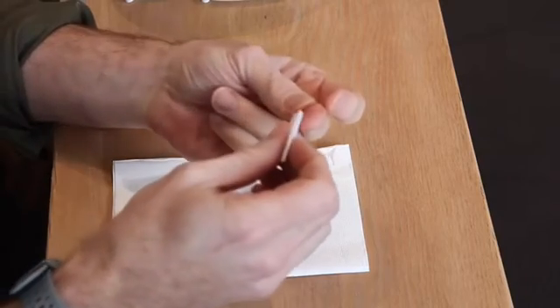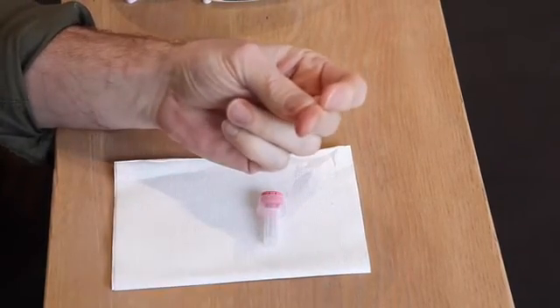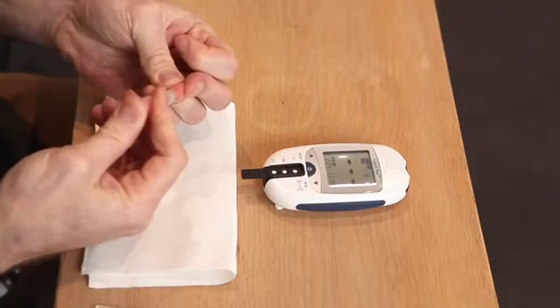Testing your lipid profile. Take one of the Lipid Pro testing strips and insert it and turn on the Lipid Pro monitor. Prepare the finger for the blood draw. Take an alcohol wipe, wipe the finger, and then use the lancet to draw the blood.